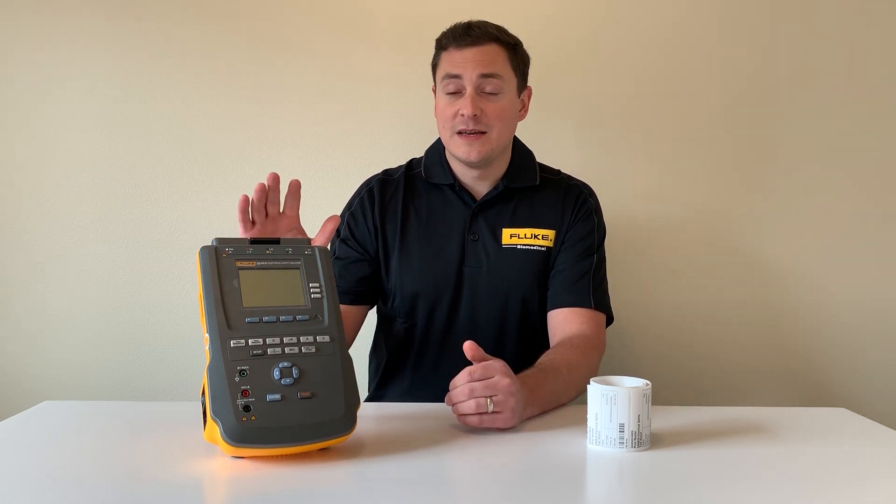The other great thing is that you can automate the ESA portion of testing. So if you have an ESA 612, 614, 615, or 620, OneQA is able to take over the functionality of that device and pull the data off. It'll execute the test and populate your test report so that you don't have to. This saves you a lot of time.